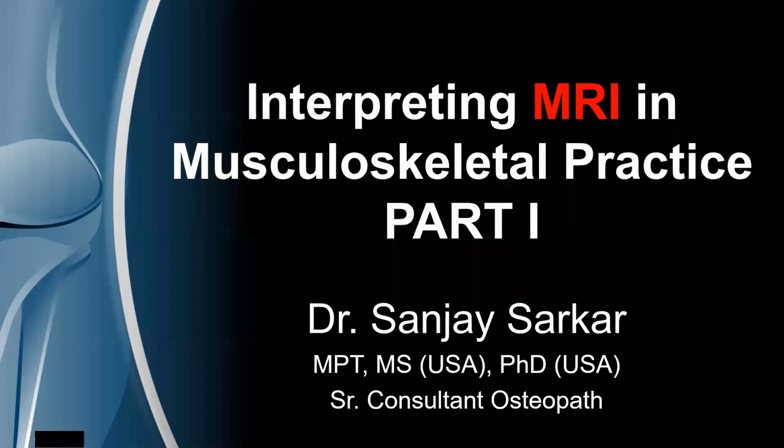But please be aware, since it's musculoskeletal practice, today's talk on MRI will focus only on orthopedic evaluation and diagnosis. So based off of that, you will not generally see MRI just because there is a fracture.